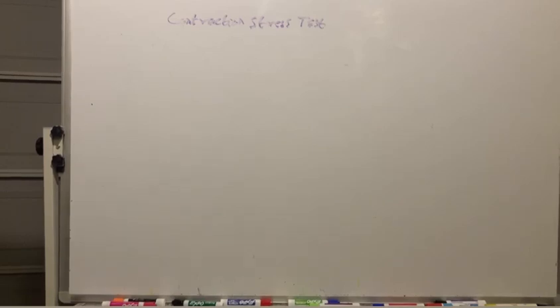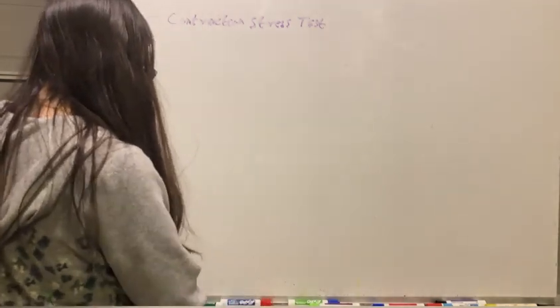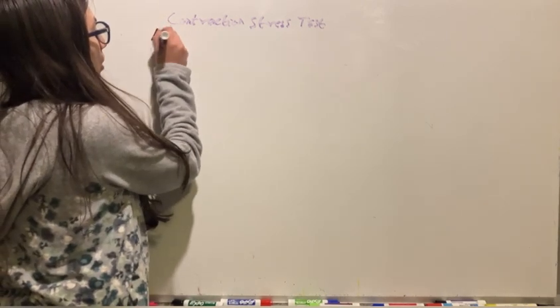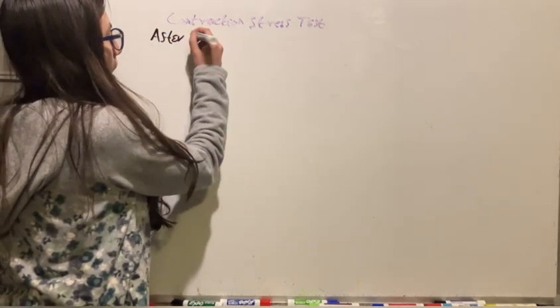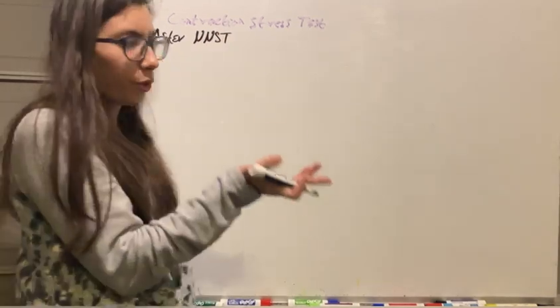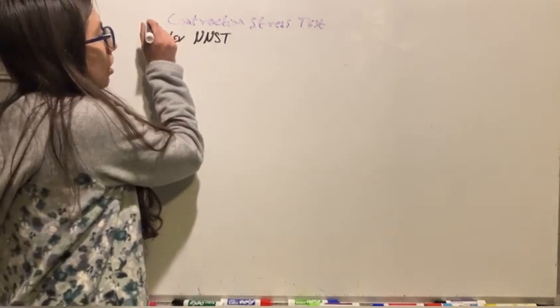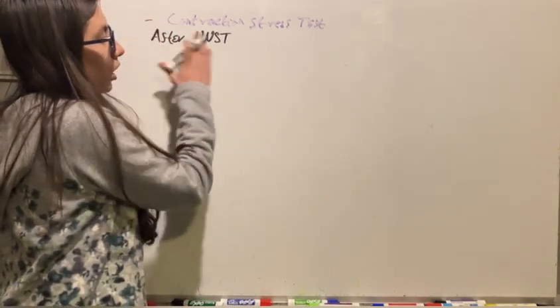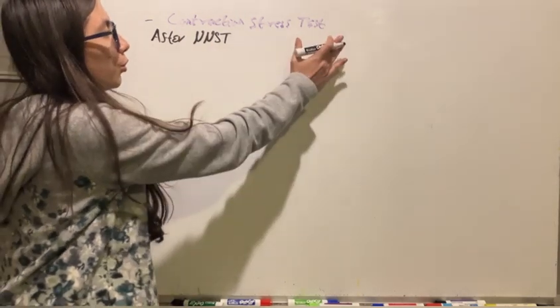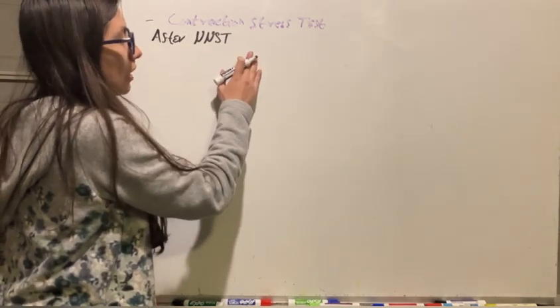Now let's review the contraction-stress test. This is normally done after we got a non-reactive non-stress test, which we reviewed in the previous video. Now, because of the cost effectiveness of the contraction-stress test, most of the time we don't do a contraction-stress test even after a non-reactive non-stress test.